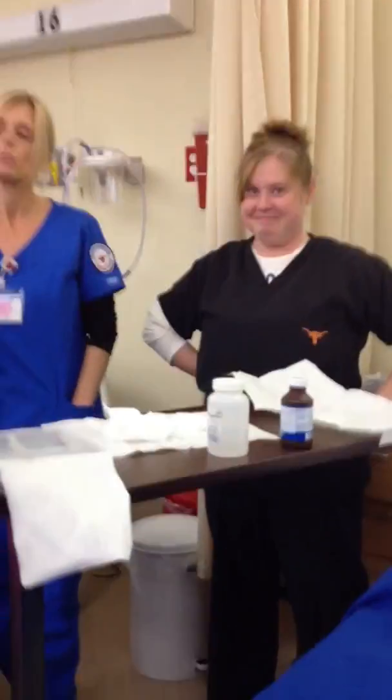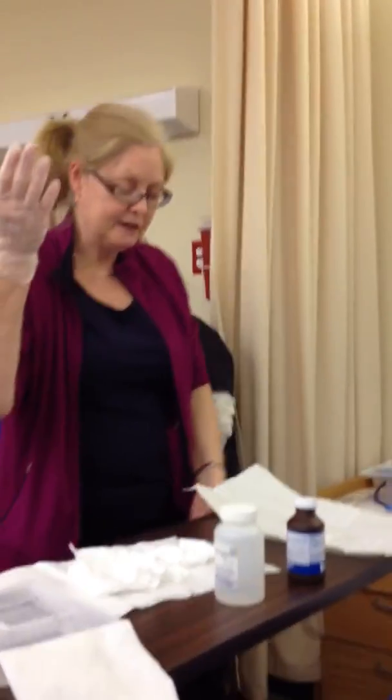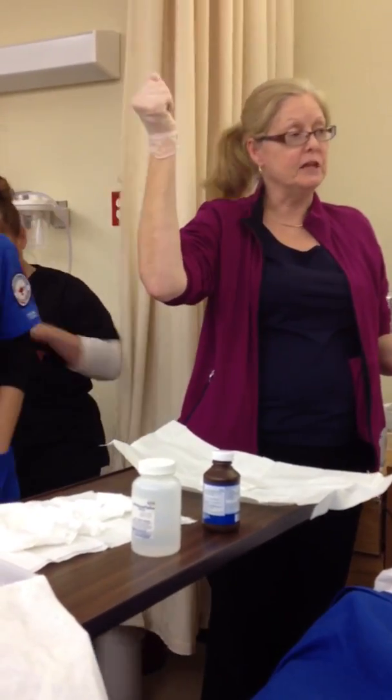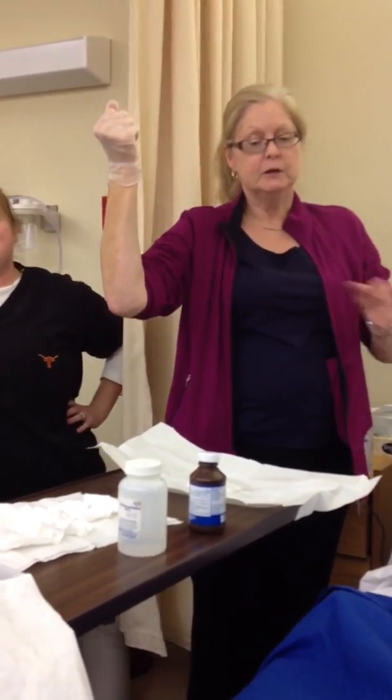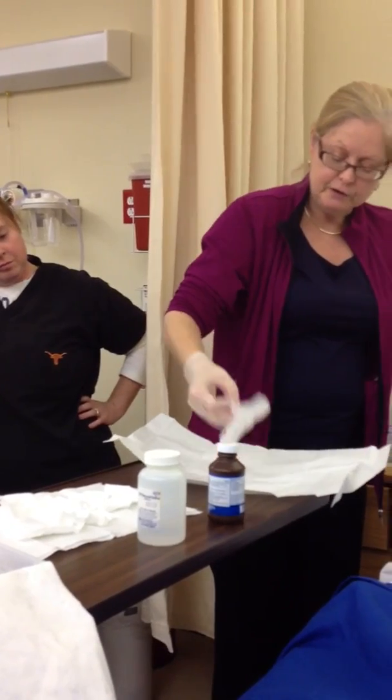Now, have I turned my back on the sterile field? Okay. So now I've got to come back over here, and just to remind you that this one hand is sterile, you can even keep it fisted at all times. Do you see what happened is I've set up the sterile field using one hand pretty much. So now I've got to get over here and get my other glove on.